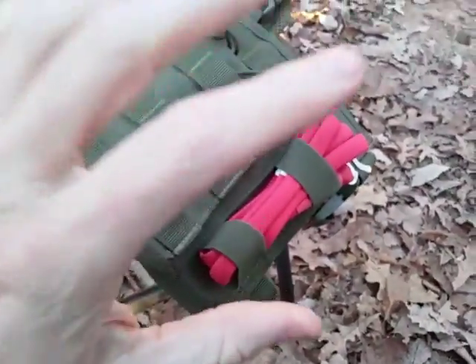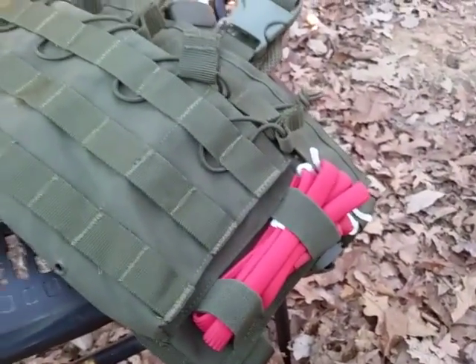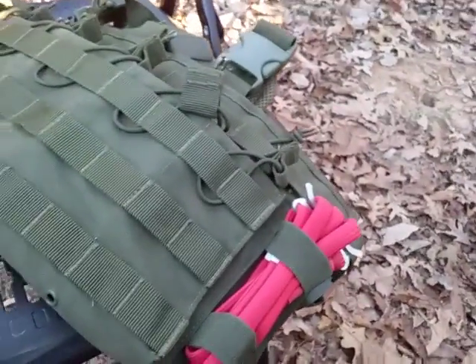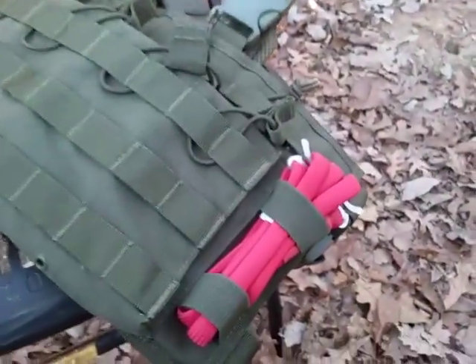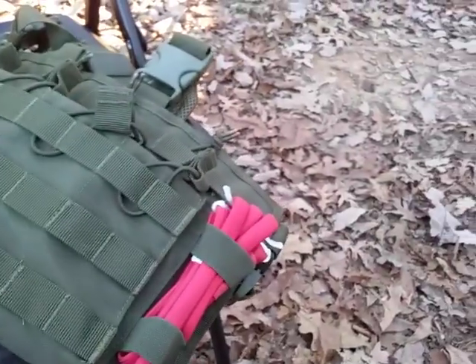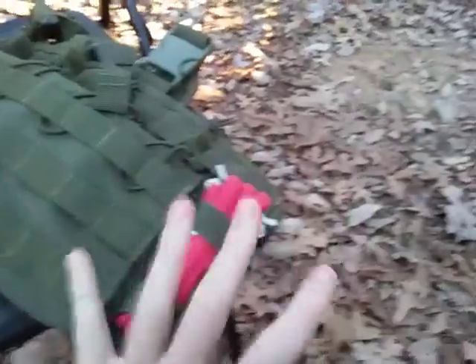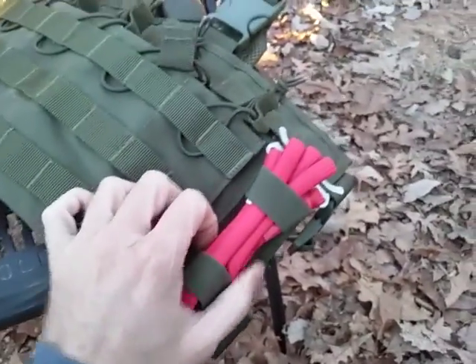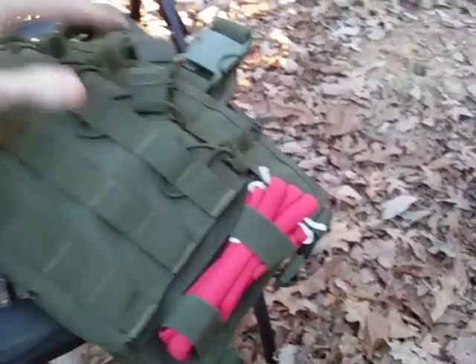So if you get the RATS tourniquet or the SWAT-T, it's not that bad of an option. If you get a CAT tourniquet, that's great. It's maybe even a step up in some ways. And if you get the SOF-T, especially the wide, I think that's pretty much the premium. So you just have to see what you're comfortable with, what your budget can give you, and whether you feel you can put these on one-handed. That's why it was awesome for me to get some extra of these RATS, because it's so easy for me to put them on one-handed, especially when I'm going out shooting.